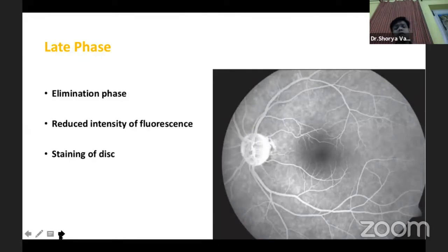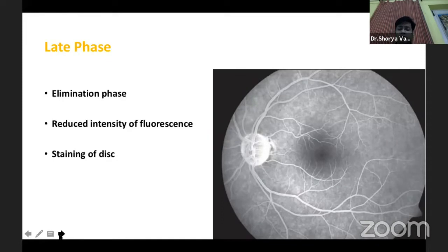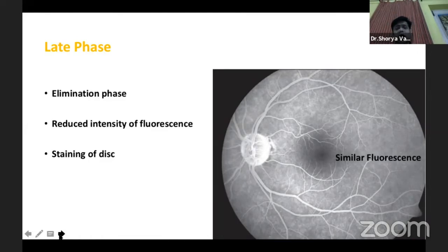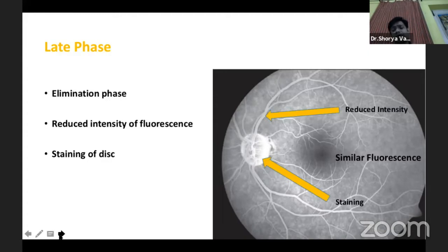Then we go on to the late phase, where the dye has traversed the whole retinal vasculature and is now gone. Some amount has been excreted and comes back into recirculation. In this phase there is similar fluorescence of both arteries and veins, but the intensity has gone down, and you will see staining of the optic nerve head.